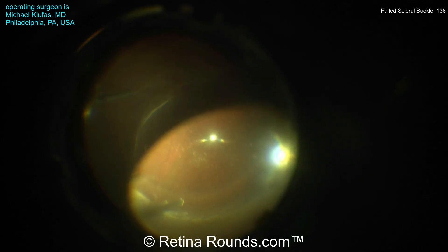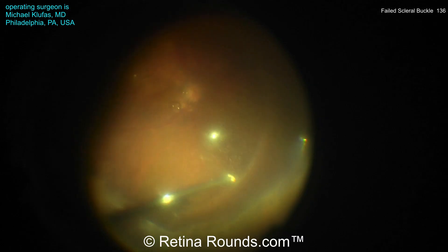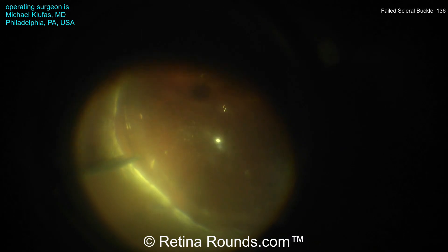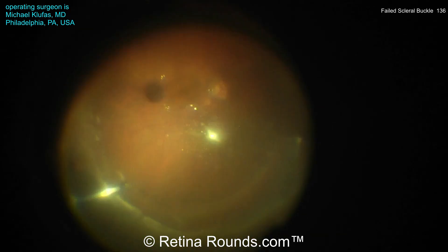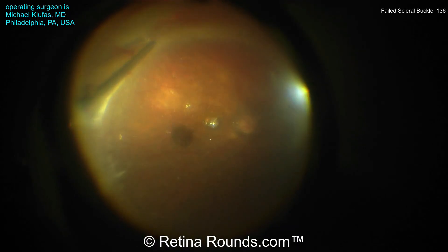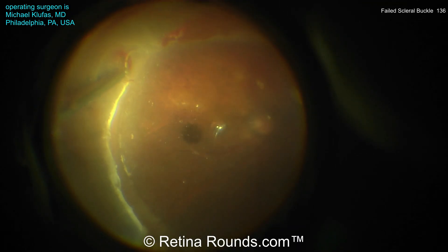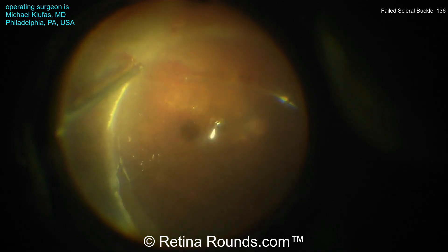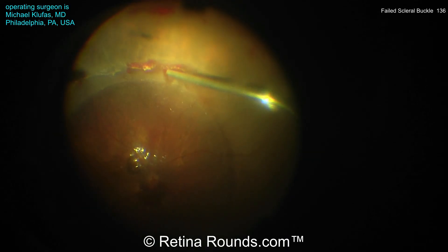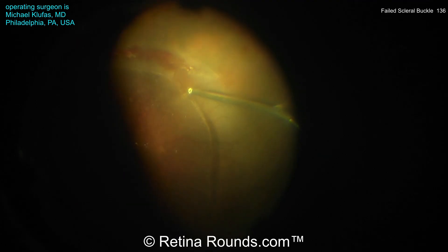Now you can see some additional vitreous shaving being performed 360 degrees. You can see the buckle contour here, which looks to be well positioned — it looks like it's circumferentially supporting the posterior extent of the vitreous base. You can see some hemorrhage is present proximal to some areas of lattice degeneration as well as a more anteriorly located retinal break. And in this phacic eye, you can see he's switching between two hands to thoroughly trim back the vitreous right at the posterior margin of the vitreous base.